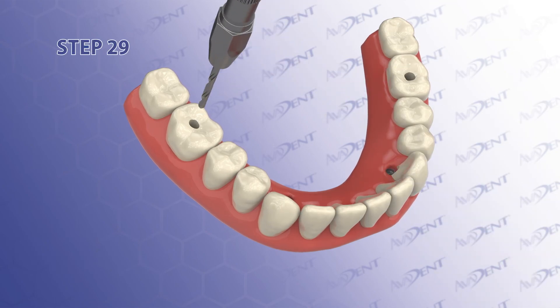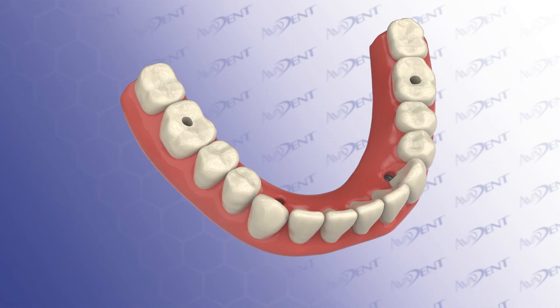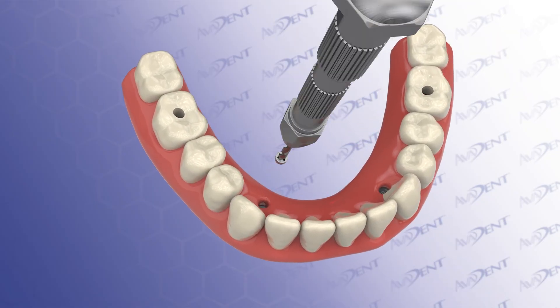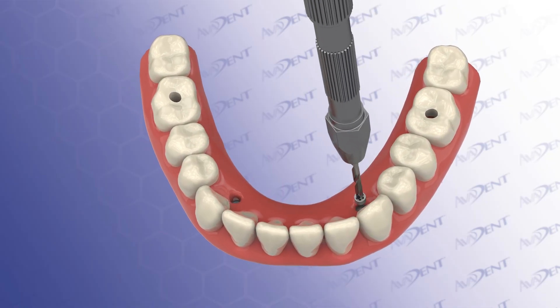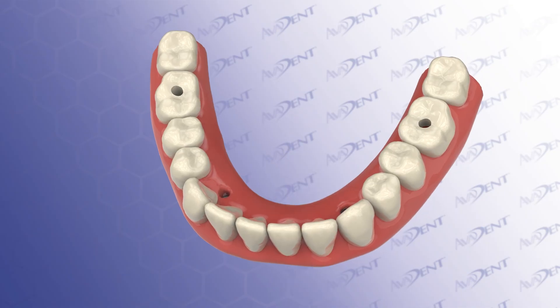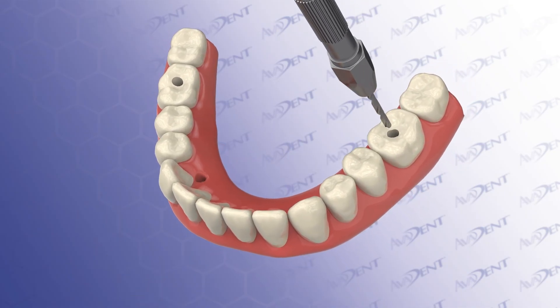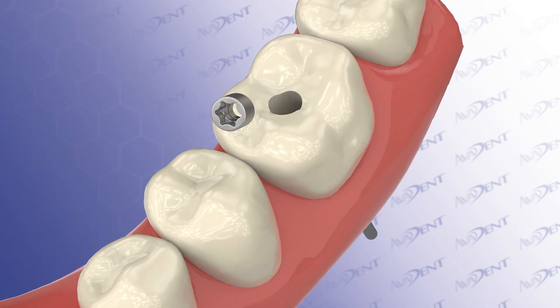Step 29. The last step of the creation of the screw channel uses a third drill in a hand instrument called a pin vise. Rotate the drill by hand in a clockwise direction until you've created a straight line access to the tie base and a hole clear of debris to allow the peak head of the separable fastener to come out. Sometimes it comes out with the drill; other times you can easily push it out with the pilot drill from the intaglio to the cameo surface.